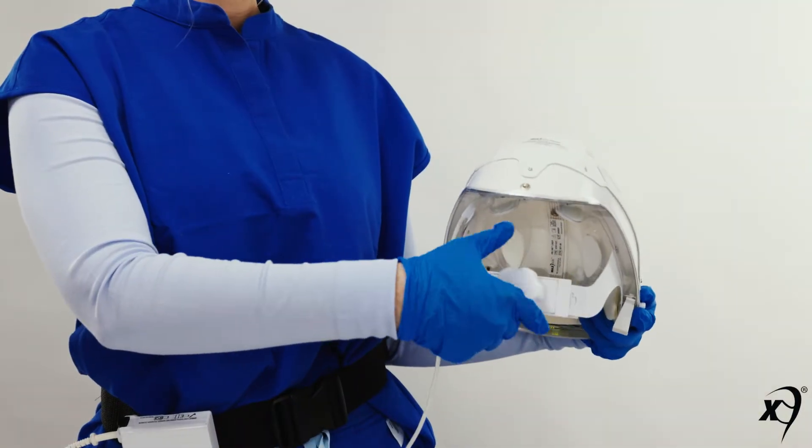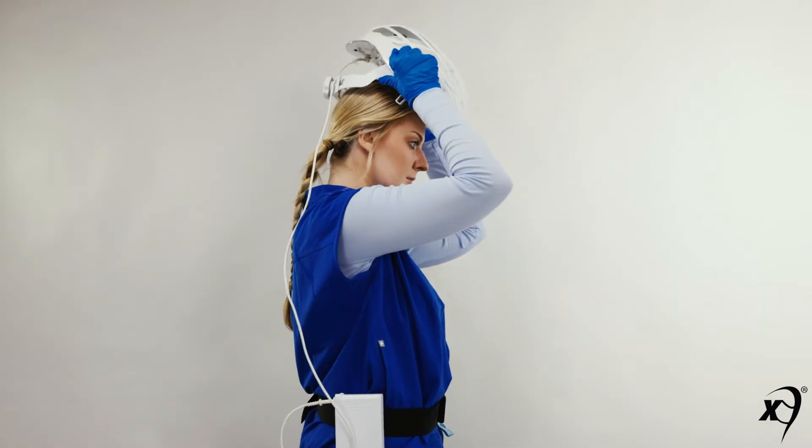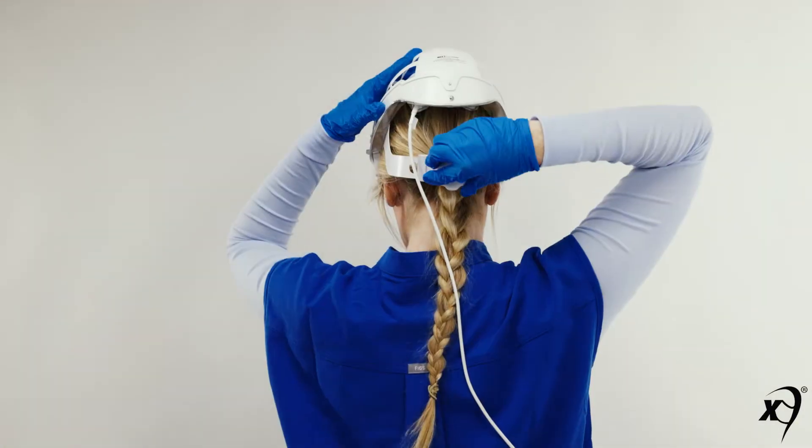Loosen the ratchet knob and don the helmet. Then tighten the ratchet knob.